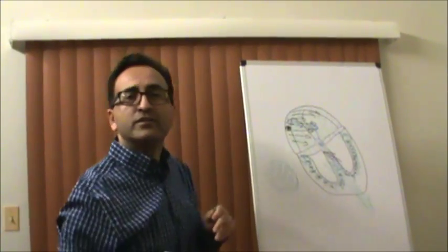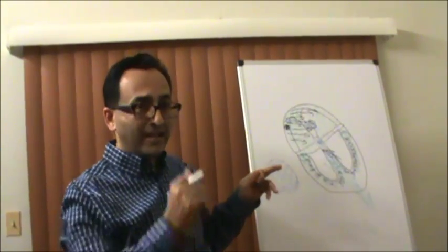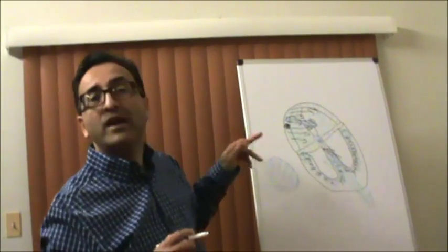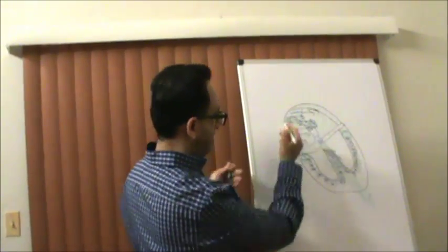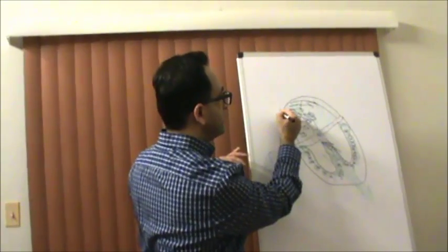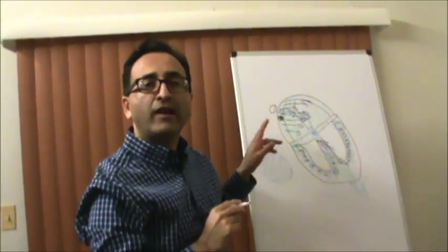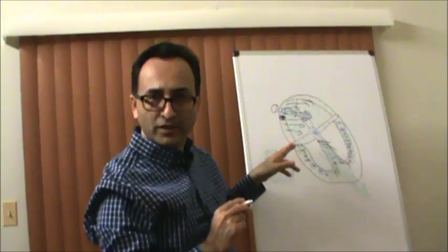So if you notice in this complete cardiac cycle, there are 5 important events that have been portrayed here. First is this, the depolarization of atriums. Okay, moderate vectors, moderate velocity.